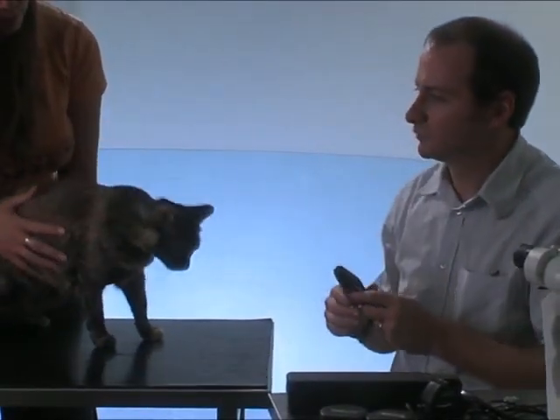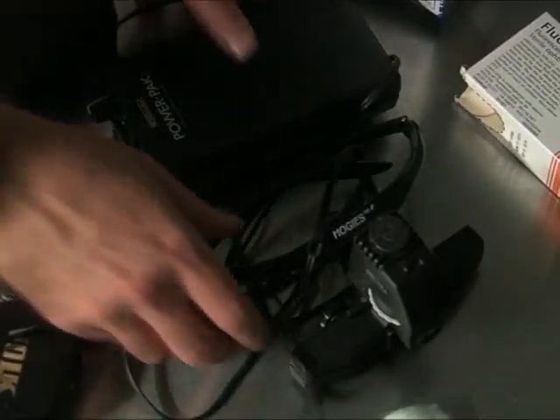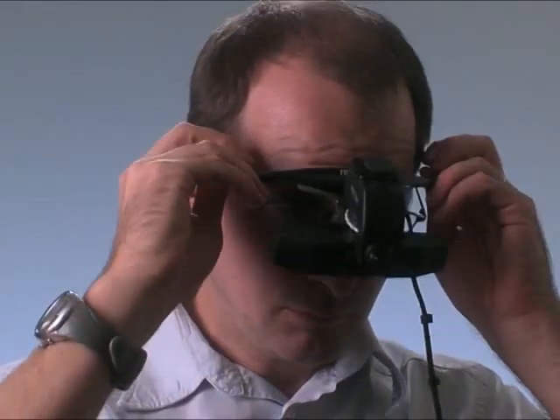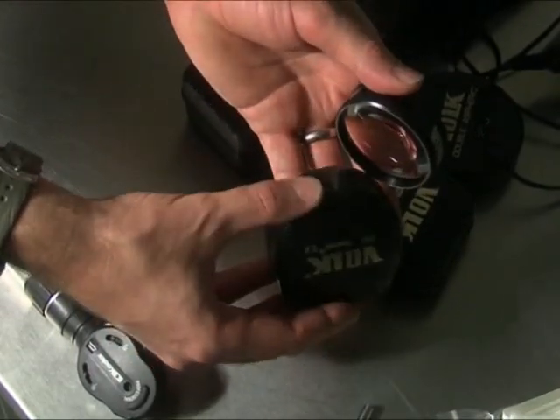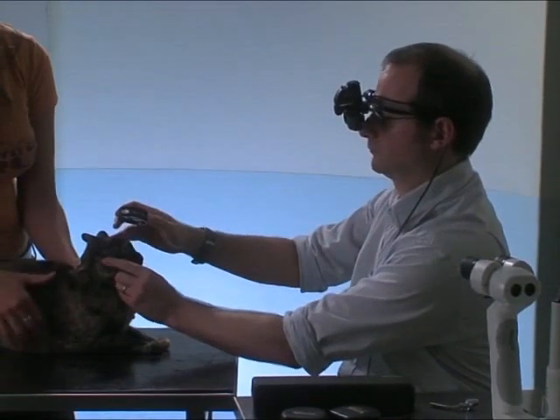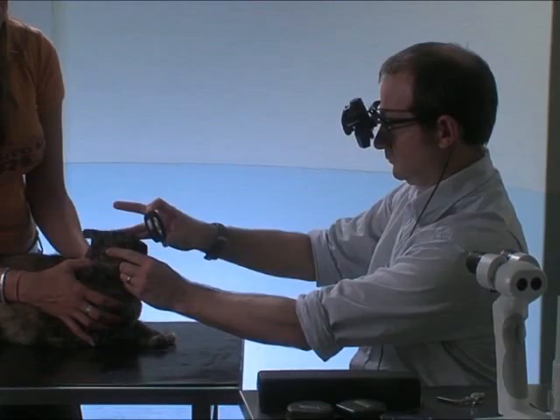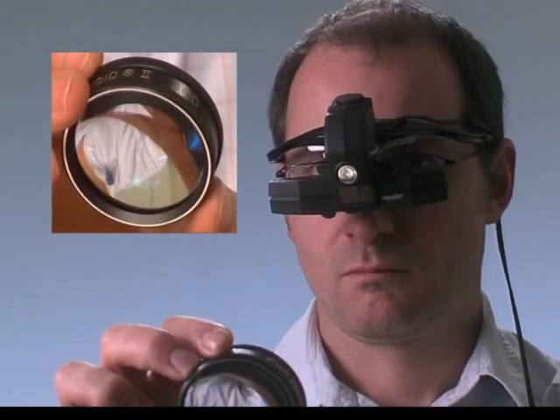In contrast to direct ophthalmoscopy, glasses should be worn if necessary for the indirect technique. Again, a darkened environment and adequate pupillary dilation are required. With the examiner at arm's length from the animal, the lens is brought into position close to the animal's eye. Note that the lens has a silver ring on one side, and this side should face towards the animal.